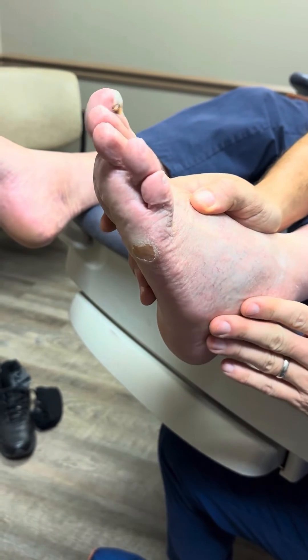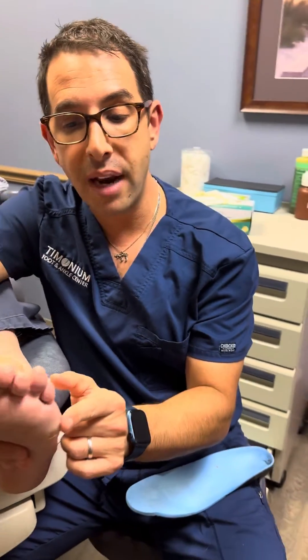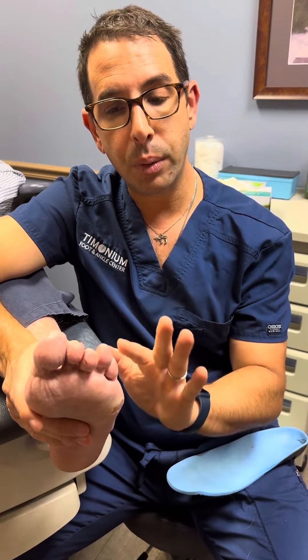This is a very hard condition to treat conservatively. When we treat things like this conservatively, we want to try to offload the area. The treatment for this is going to be to shave this callus down, which we did. If needed — we did not do this yet, and it doesn't look like we're going to need to at this point — we can always consider putting a dermal filler in here. But the main goal of this was to offload this.